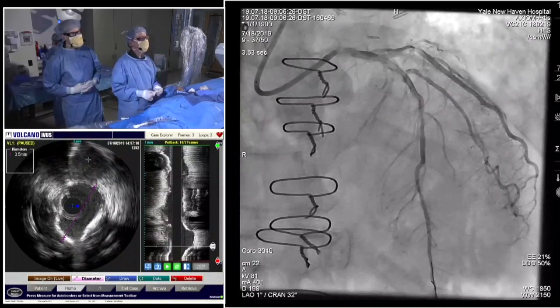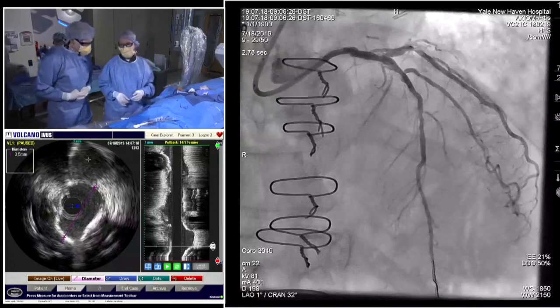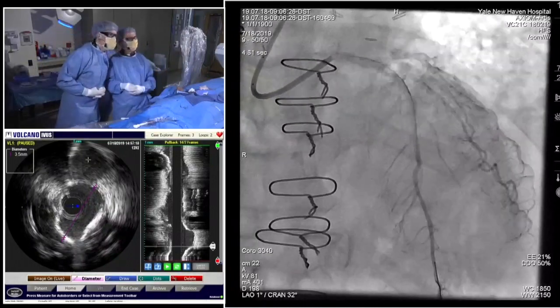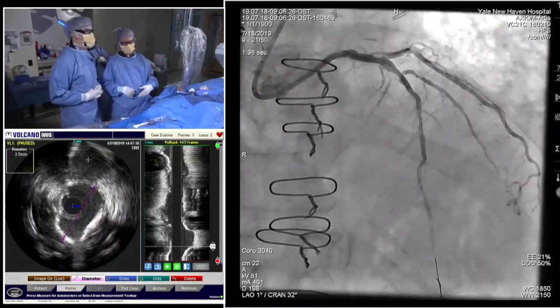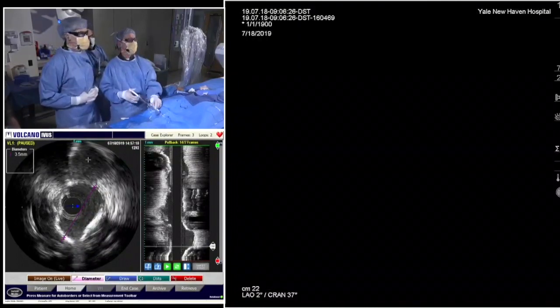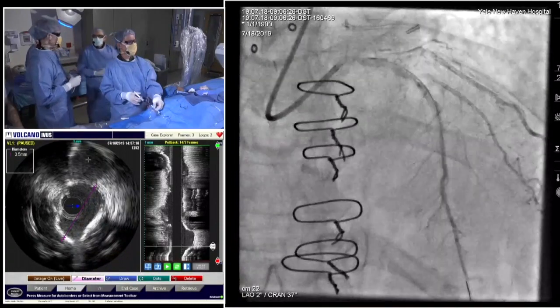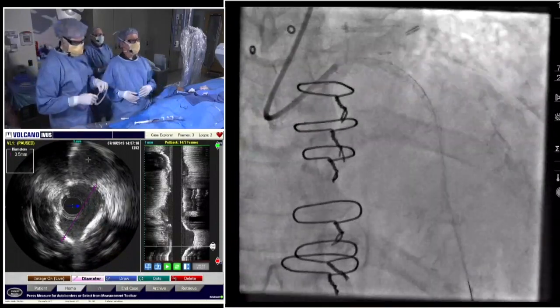And all the manufacturers have sort of dimensional capacities typically on the box. If not, there's charts. We actually have a chart in our lab that we made up that has all the different stent types and what they go up to. But I think with a 2.5, you're going to be able to get up to where you need to get, at least in the LAD, and then take a different stent more proximal to that.